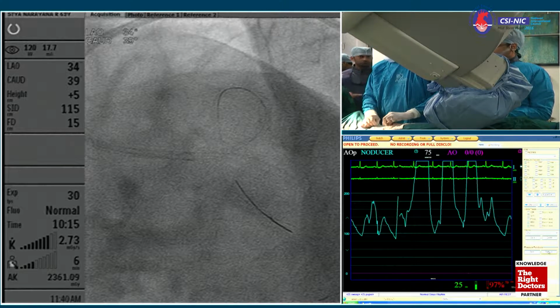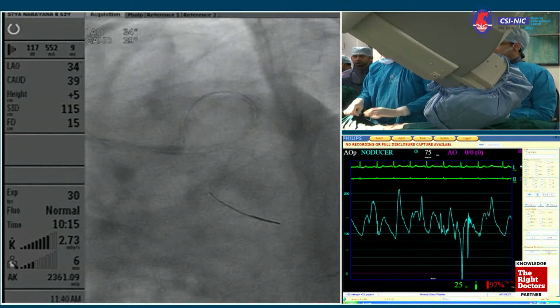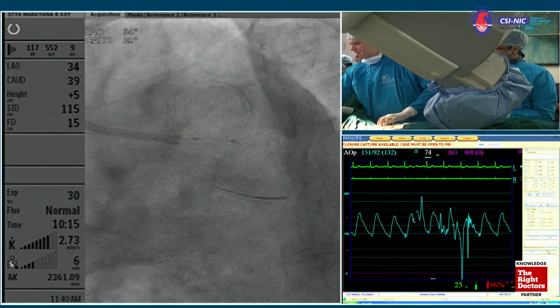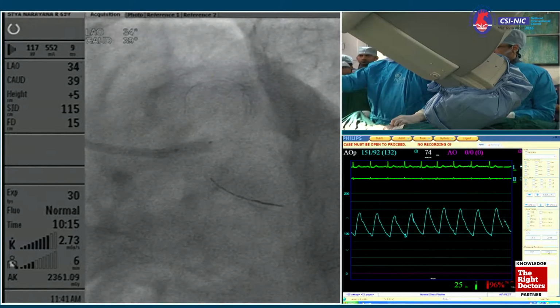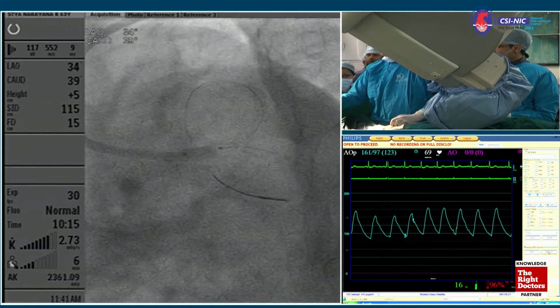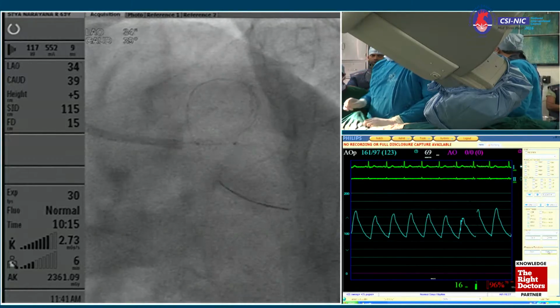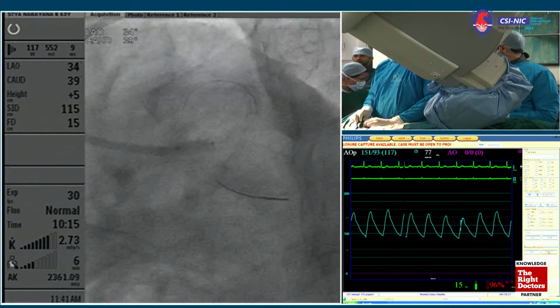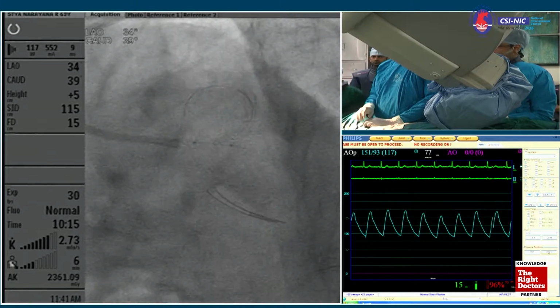Well, Hui Chim, I fully agree. And you could see maybe from our attempt to do the POT that the balloon moved out backwards. So, sorry, but what size of balloon was this? That was a 4.5 for the POT. But it moved out backwards. You can see nicely here. So I agree with Hui Chim. That is a good suggestion. We will first optimize the ostium with the 3.5 NC balloon and go just straight over the ostium and make it as big as possible, and then go again with our POT and then rewire the LAD.